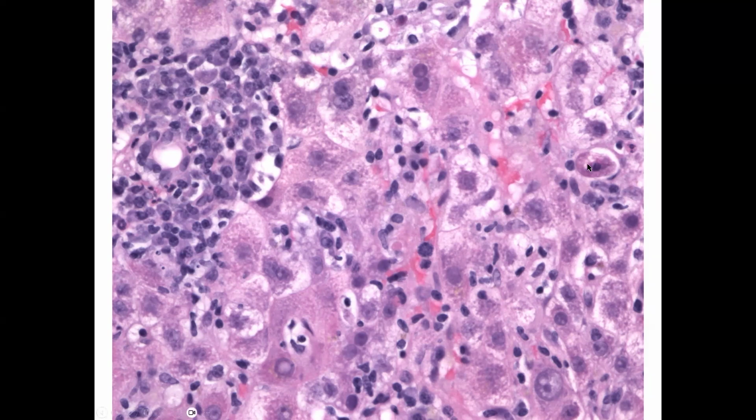balloon hepatocytes. And then you can see here the cell's actually just dying right now. So the nucleus is getting shrunken and pyknotic, and the cytoplasm is kind of collapsing down. So this is basically a dead cell here.